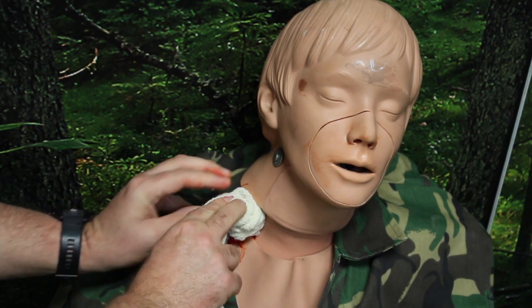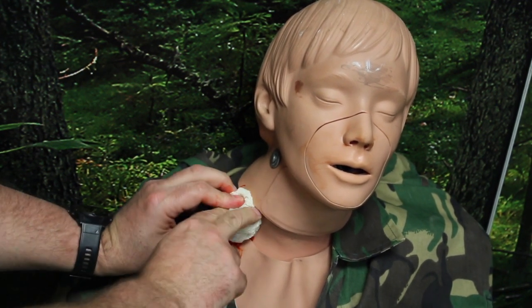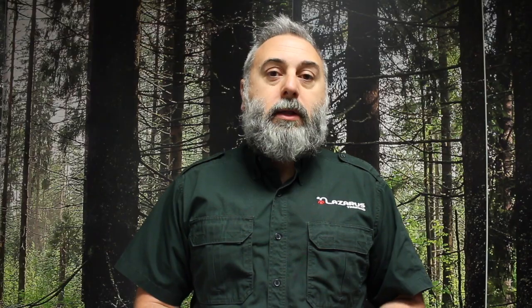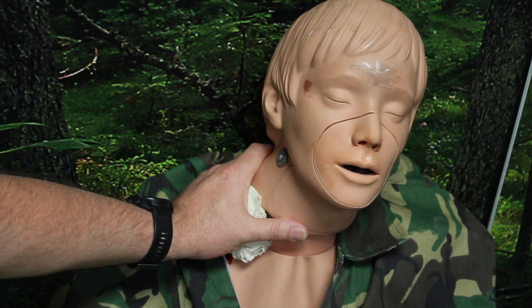This might take more than one pack. We keep packing until we've filled the wound site and the dressing protrudes past the wound site. The fact that the dressing is sticking out will help us continue to put pressure on and secure it. It's going to be uncomfortable if the person is conscious but we need to know that we're doing the best thing for them. Having maintained the pressure on the wound for at least three minutes — a minimum three minutes — we can now have a look and see how we're getting on.